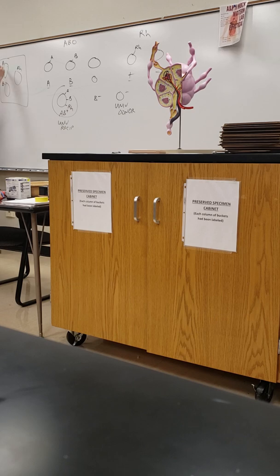So if I end up with smooth blood, clumpy blood, what do I got? Deep. I tried. But this is anything that stands out, right? Anytime you get a reaction, that indicates the presence of that particular marker.